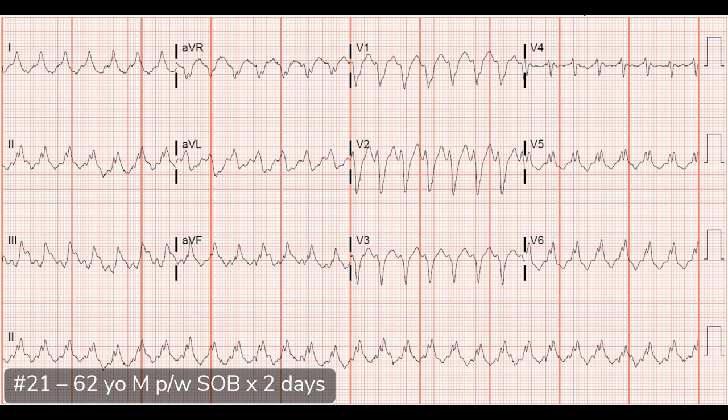Next case: a 62-year-old gentleman who came in with shortness of breath for a couple of days. What I see is a wide complex tachycardia — and we're definitely going to beat this to death. We already had a few wide complex tachycardia cases, but I can't stress enough: wide complex tachycardia is ventricular tachycardia. Unless otherwise proven. If you just remember wide complex tachycardia is ventricular tachycardia, you're really never going to get in trouble.